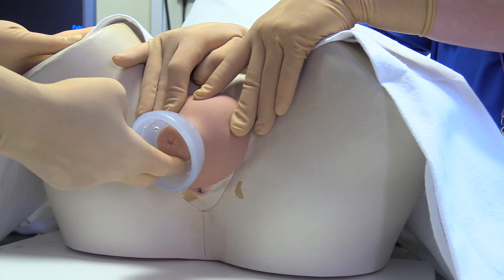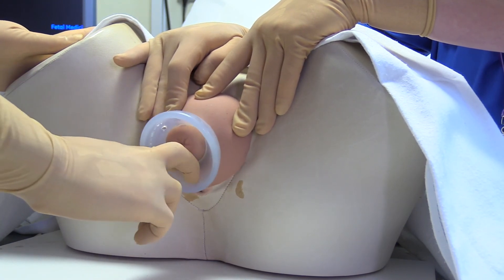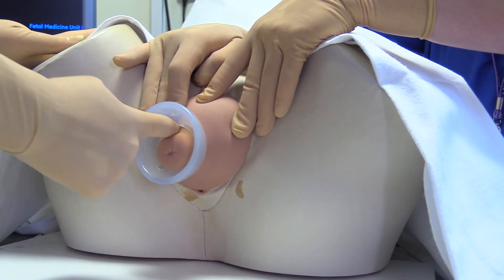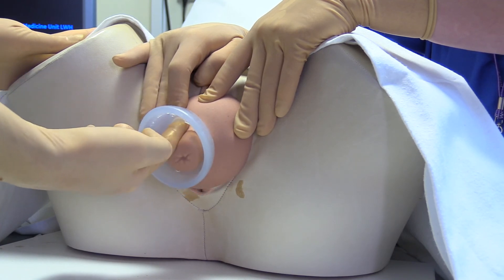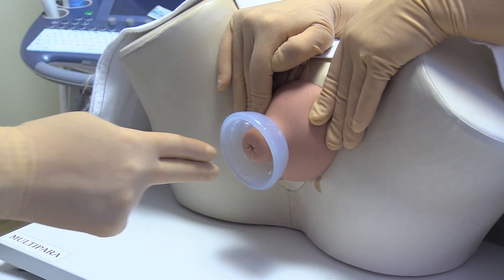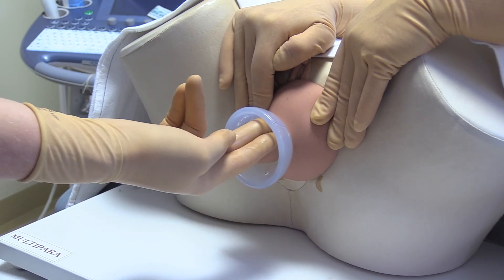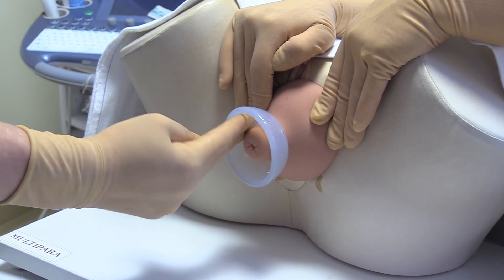When it is not possible to directly insert the finger under the pessary anteriorly, the finger should be inserted between the pessary and cervix posteriorly. The fingers are then rotated anteriorly and the pessary is then removed in the normal way. Alternatively, it is possible to insert the finger between the cervix and pessary posteriorly and bring the pessary over the cervix from this position.